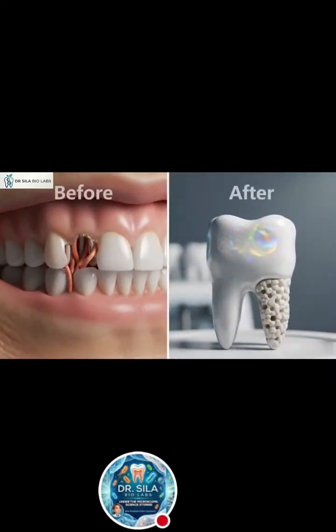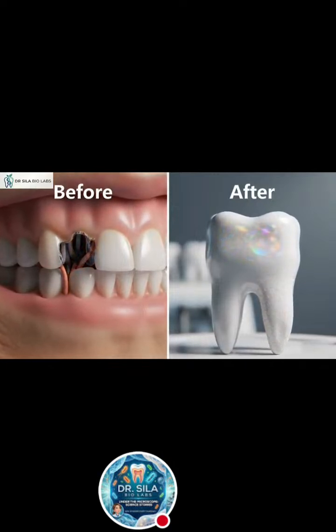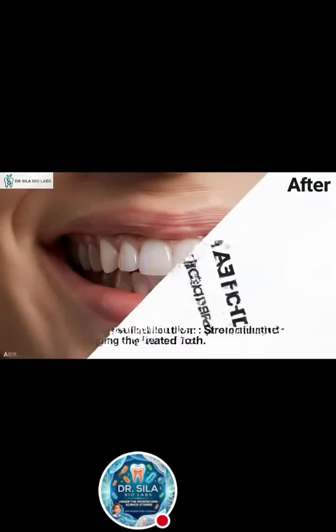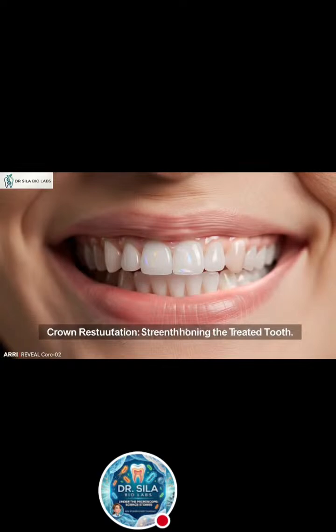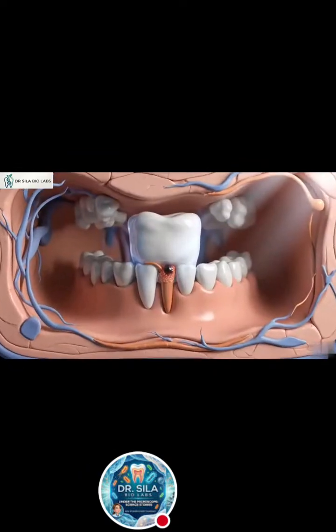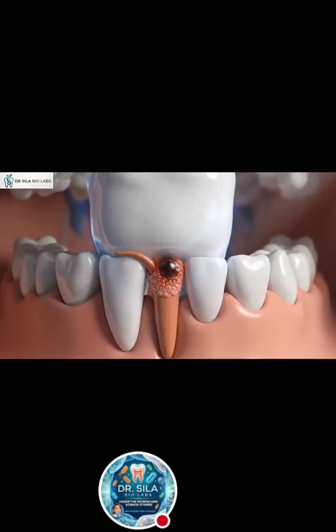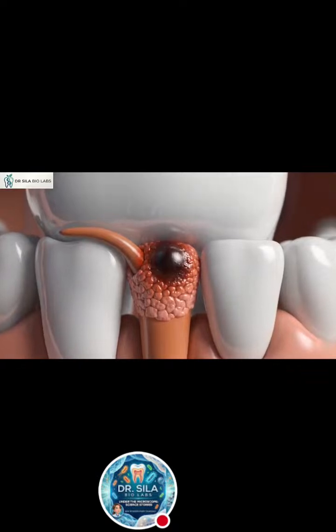The core buildup reconstructs the tooth structure, allowing the final crown to provide complete protection and a natural look. Once the crown is securely cemented into place, the treated tooth can function normally again. We begin with a detailed view of the restored molar. The root canals are perfectly sealed with gutta percha.